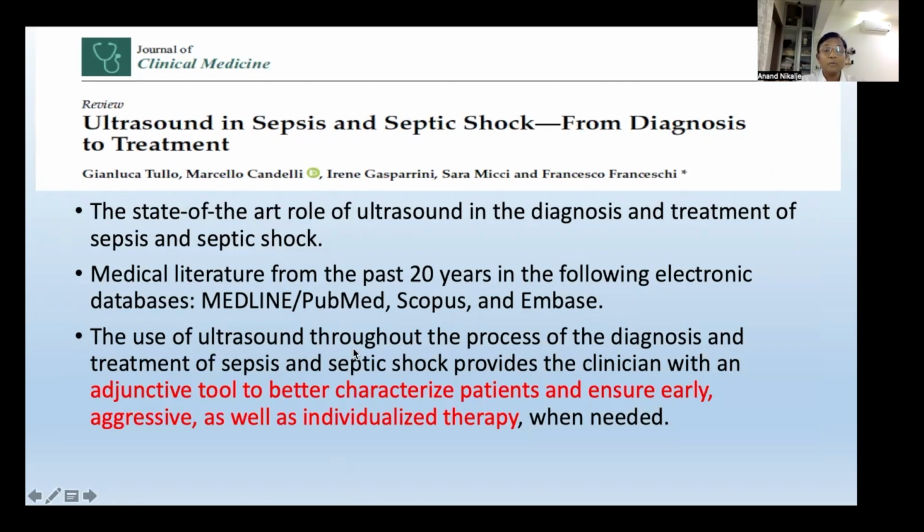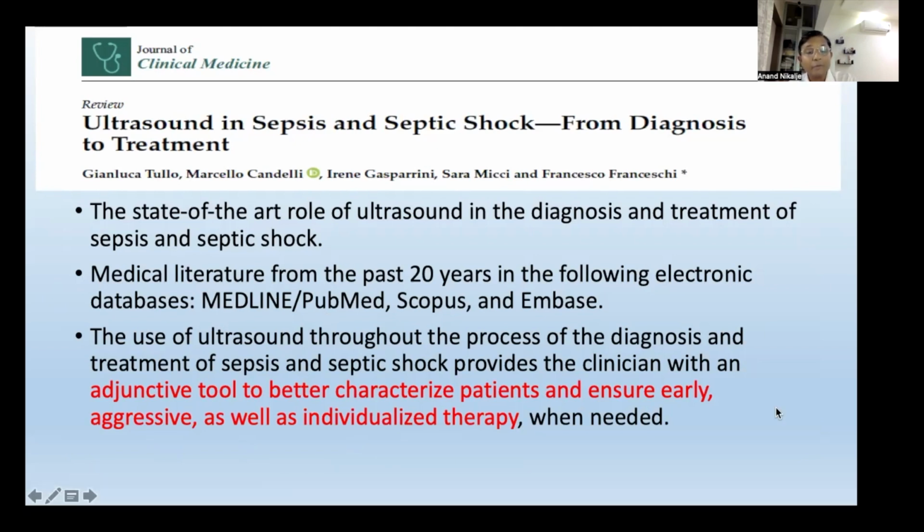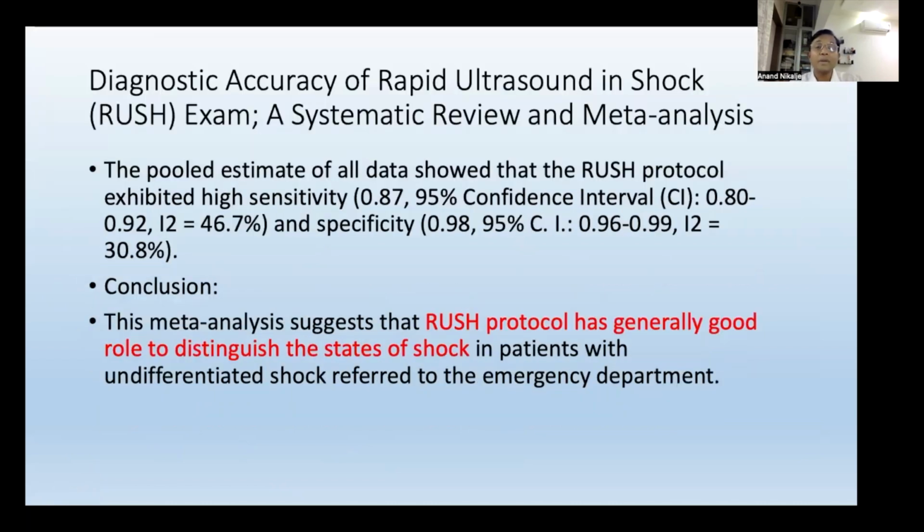And the use of ultrasound throughout the process of diagnosis and treatment of sepsis and septic shock provides the clinician with an adjuvant tool to better categorize the patient and ensure early aggressive as well as individualized therapy in a shock patient. So this clearly says that we now require an individualized approach for management of shock. And if you use ultrasound at the bedside, it is a good adjuvant tool for categorizing the shock patient and ensuring early aggressive treatment.